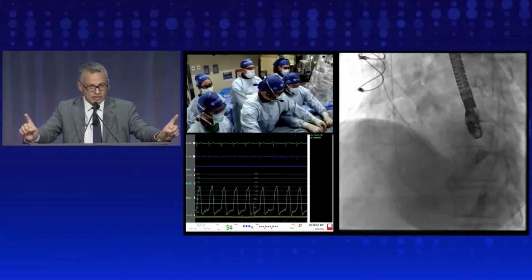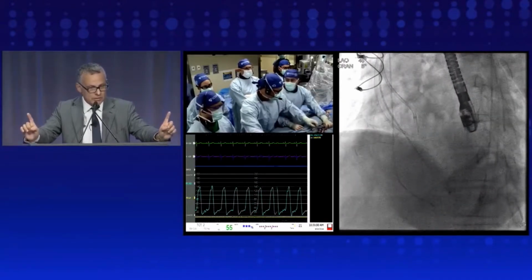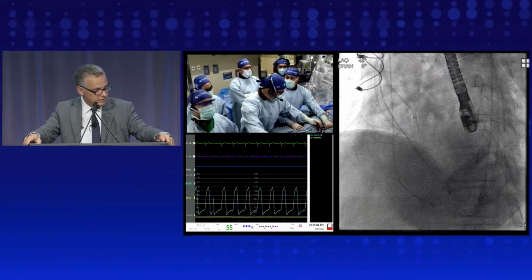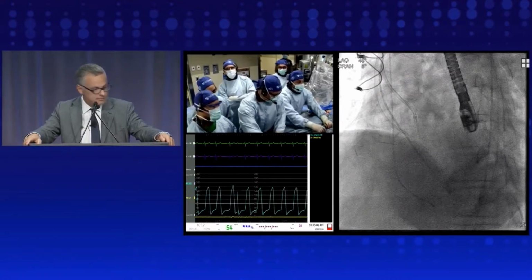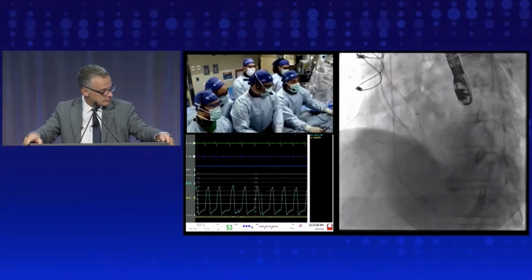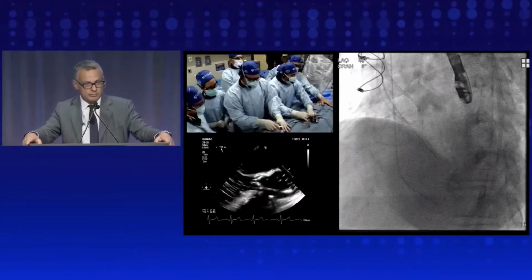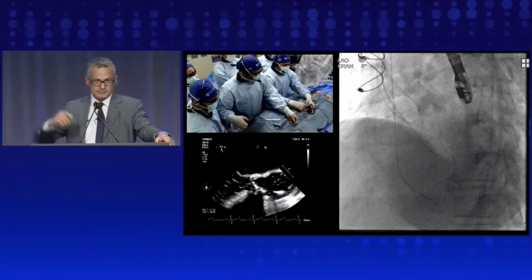Before you start, I want to ask you one single question about the implantation. You want to go a bit lower, I imagine, with this implant. Yes, absolutely right. In this particular case, we're going to use a CoreValve and go a bit lower. Absolutely. All right, so now you focus on your procedure because I think it's fundamental.